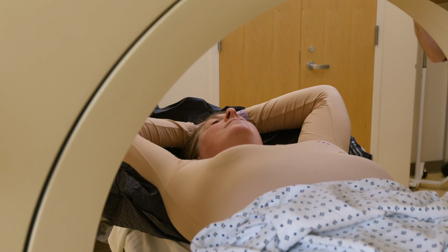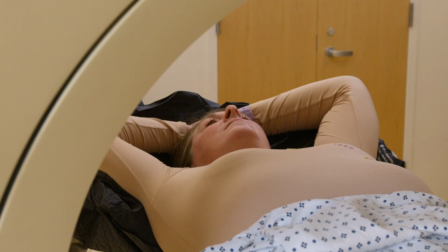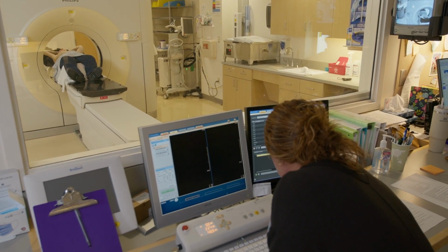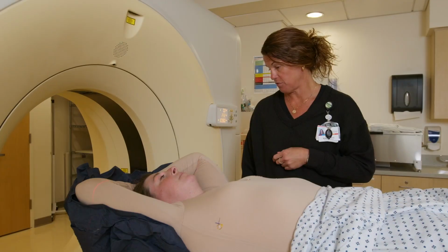The experienced therapist will be able to see when you have started your breath hold. Once you're in the breath hold, the CT scan will begin and only takes 10 to 15 seconds. The therapists communicate via the intercom as soon as you can breathe out through your mouth. Please remember to keep holding still between breath holds. If at any time you can't hold your breath, let it out and breathe normally.